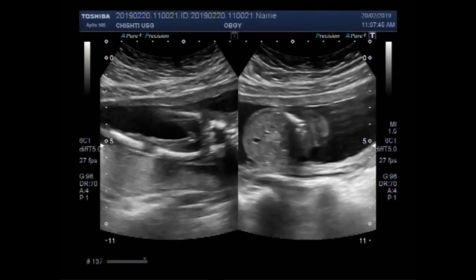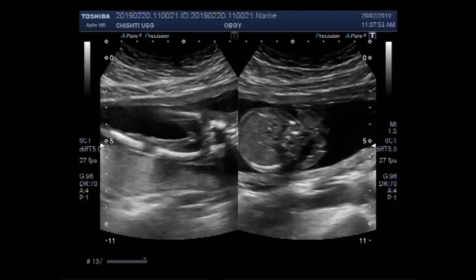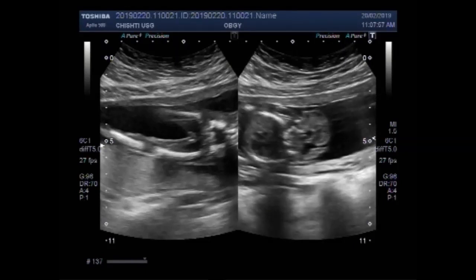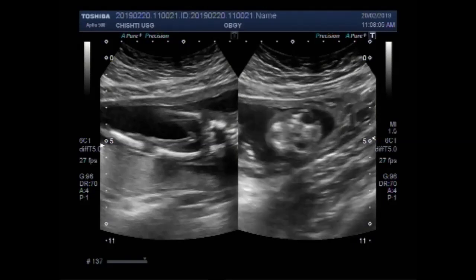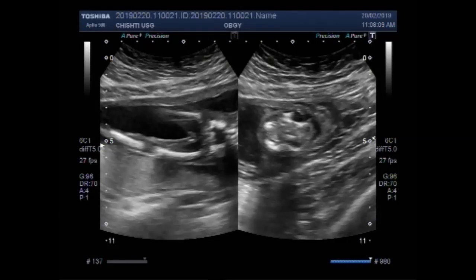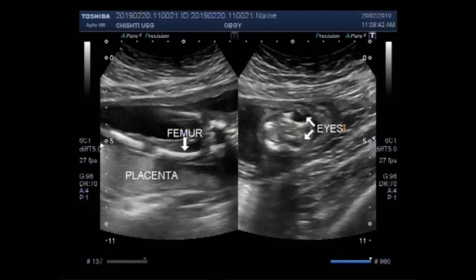Anencephaly is a neural tube defect. This is the femur. And these are both eyes — prominent eyes. The head end of the neural tube failed to close.